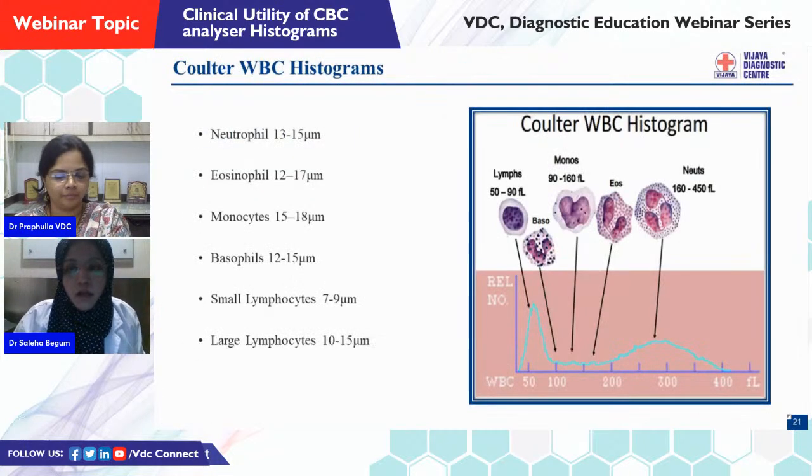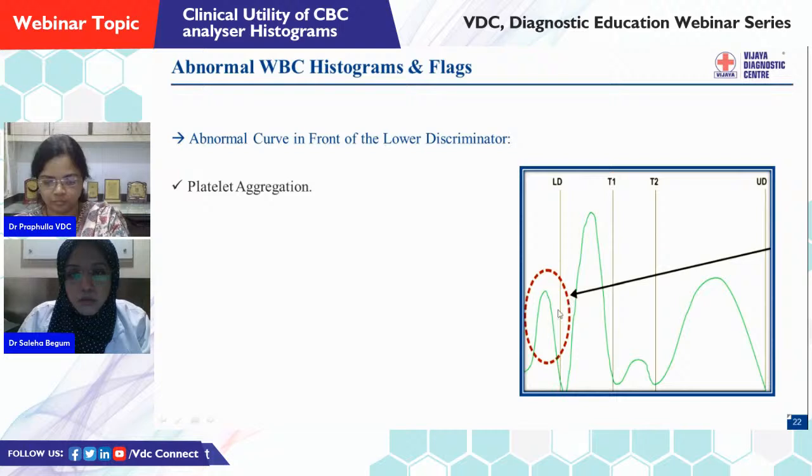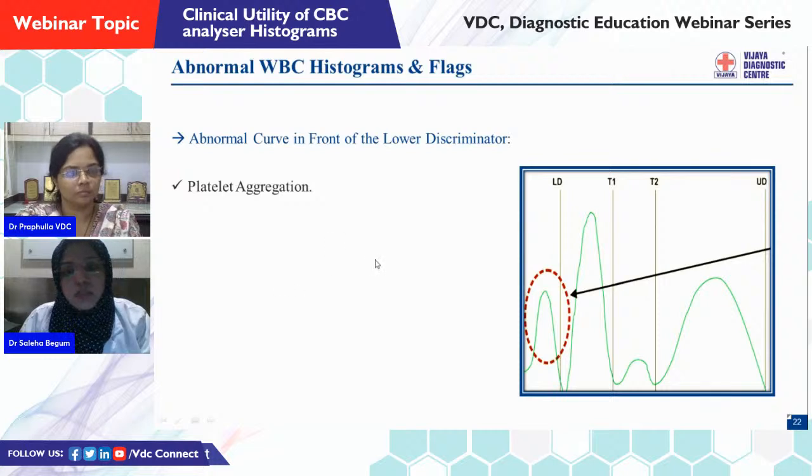So, having understood the normal distribution of cells in a WBC histogram, let us see the variations from the normal. Here you can make out an extra peak just before the lower discriminator, meaning that there is some population inside the patient's blood which is smaller than a small lymphocyte. So what could that be? Usually in cases of platelet aggregation, we see such an abnormal extra peak in front of the lower discriminator.